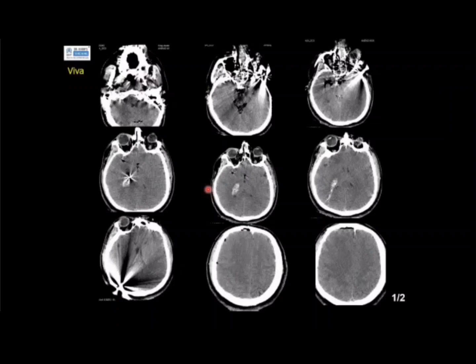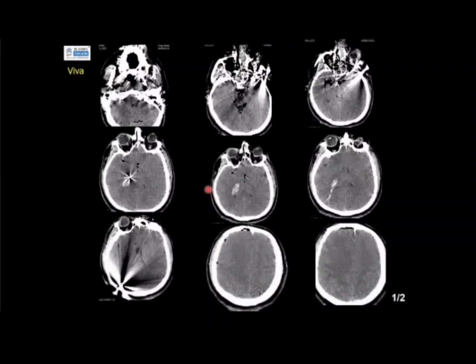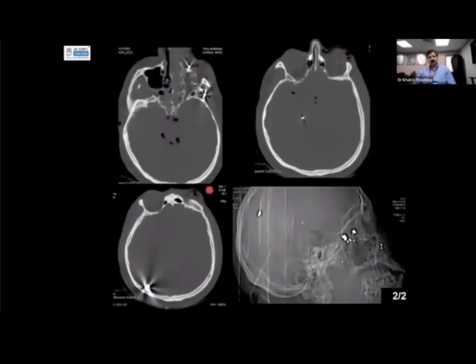This is an A&E case. This is a burr hole drainage for the... Okay, I'll take over. This is a gunshot wound. And the idea was to show you a gunshot wound just so that you don't forget it. It's easy, but you have to remember.